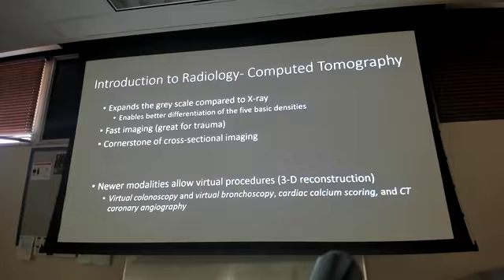It's great for trauma in a certain situation, and that is your patient is stable, right? If your patient is unstable, and we'll talk about later what to do for those unstable patients, do not send them to CT. Most ERs don't have a CT scanner in the ER, and they have to go to the diagnostic imaging or the radiology department.